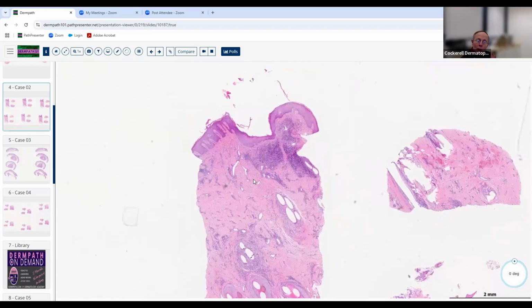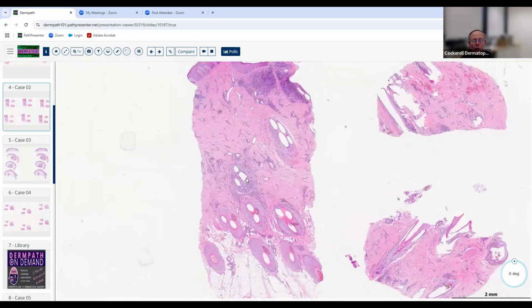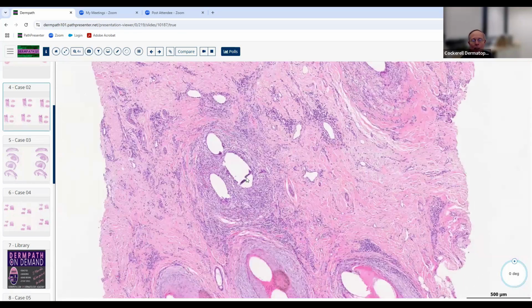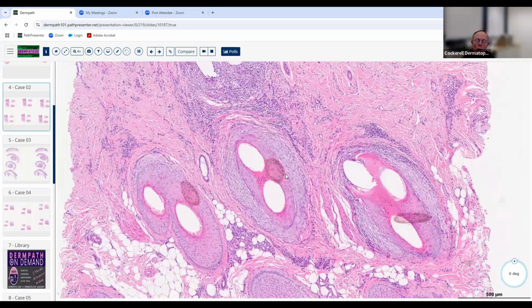And if you see the differential diagnosis between this and discoid LE, you often will see a lichenoid infiltrate in DLE. So it's kind of a paradox. You sort of think that you would see more of a lichenoid process in Lichen planus. You actually tend to see more lichenoid inflammation in the DEJ up here with DLE than you do with LPP. So this is a nice example of Lichen Planopilaris. If you go through that sort of approach that I just mentioned, you'll be able to make the diagnosis.